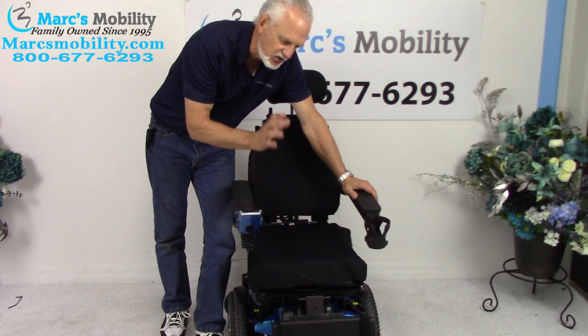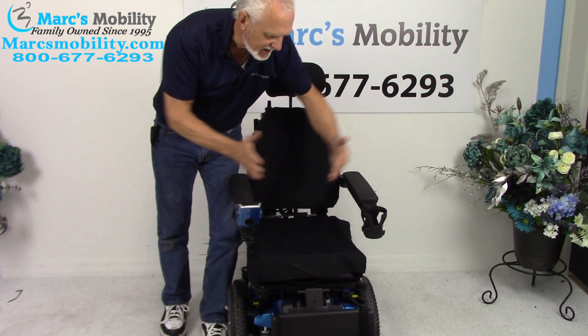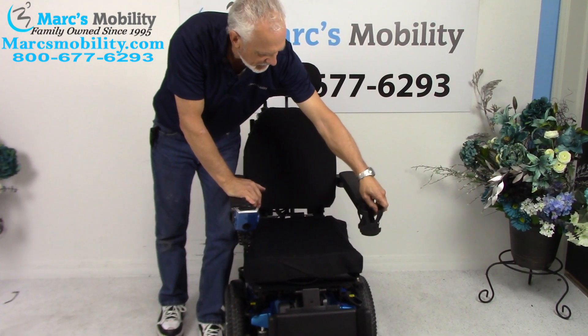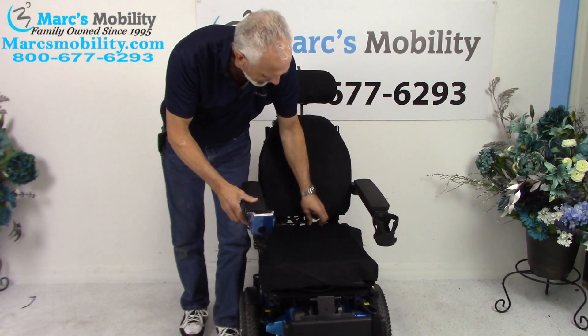These chairs are adjustable — we can adjust the size. So if you wanted a bigger or deeper seat, we can expand the arm and expand the seats. You also have a cup holder at the end of the arm that can be removed. The arms flip up on both sides. You have a safety belt as well.